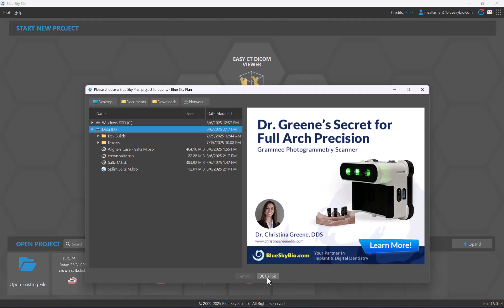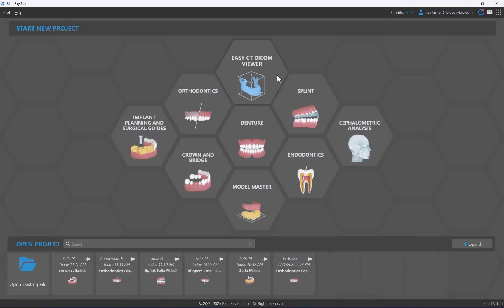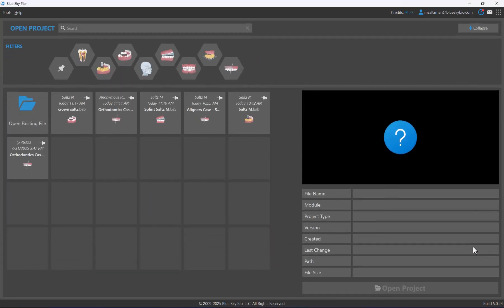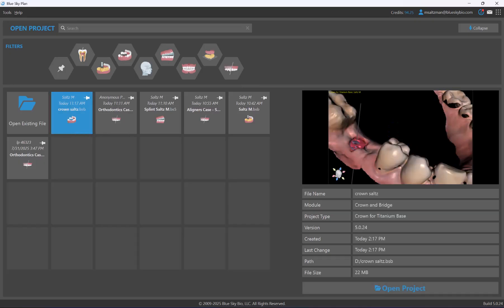The open project section can be expanded — click on the expand button and it will show many more recent projects. You can double-click on the relevant project to open it, or single left-click on a particular project to see a preview and additional information connected to that project.